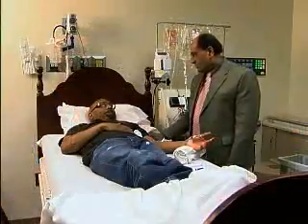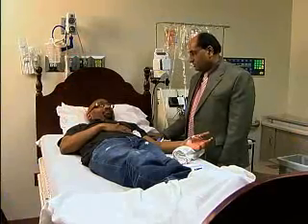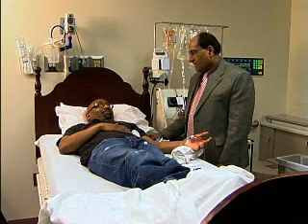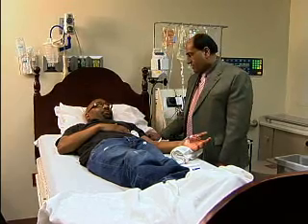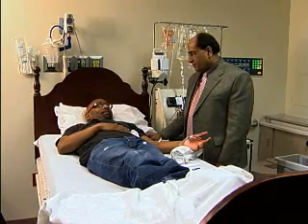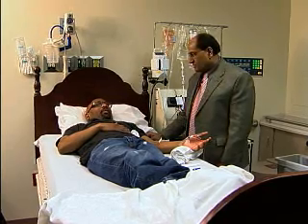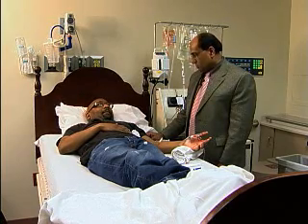So, Michael, how many plasma apheresis treatments have you had now? Just about 100. 100 treatments? And that's been going on for how many years? Approximately 9 years. 9 years? Okay. And we've been using this artery. What's the frequency of the treatments now? Depending on how well I'm doing, it could be anywhere between every 2 weeks to every 6 weeks. So 2 to 6 weeks.